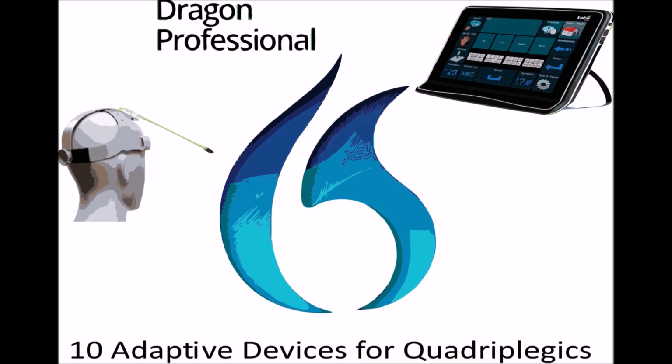2. Transfer belts. These are waist belts used to assist individuals with standing and walking, providing support and stability during transfers. 3. Transfer poles. These are freestanding poles placed in the bedroom or bathroom, providing support and stability for individuals during transfers. 4. Slings and hoists. These are devices used to lift and transfer individuals with limited mobility, such as those who are bedridden or unable to stand. 5. Transfer steps and stairs. These are platforms or stairs used to assist individuals with mobility impairments to climb steps or stairs.